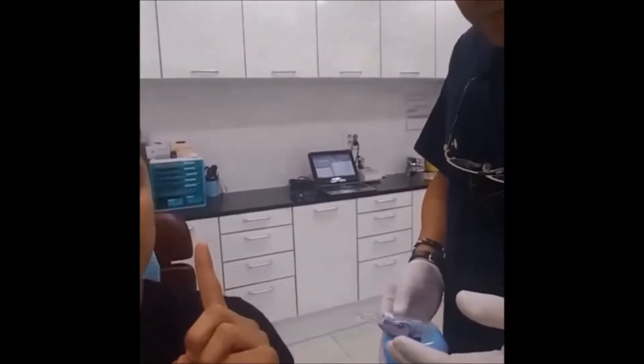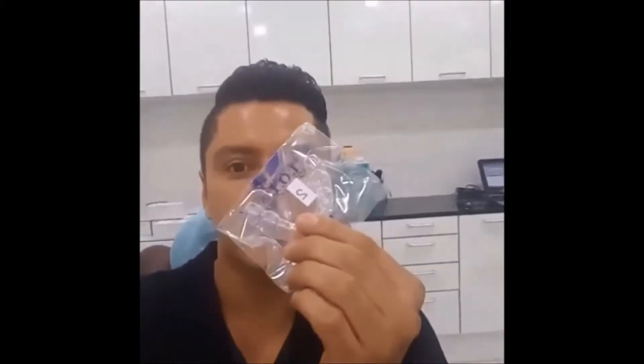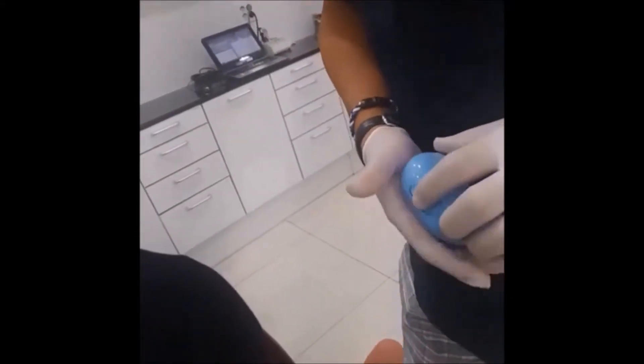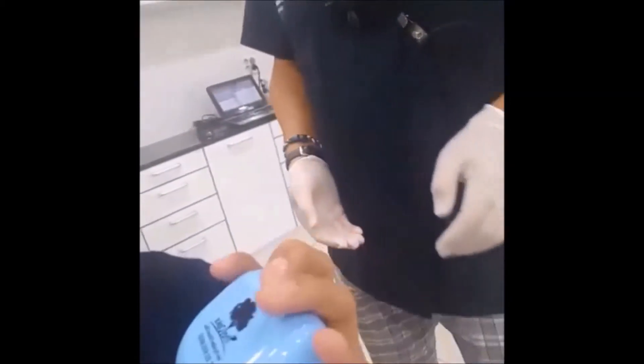It feels smooth. It doesn't hurt at all. I can feel the pressure on my teeth but it doesn't hurt. So I wear this for one week? Yeah. If it becomes looser, you should change to the second one. The second one is harder than the first one. So I wear this one for one week, and when it becomes loose, it's time to wear the next one. And they gave me a nice little case like this — it's so nice. It doesn't hurt. I like it. That's my little case.